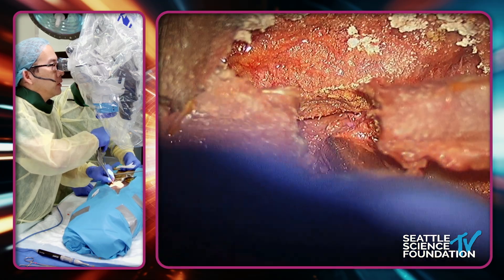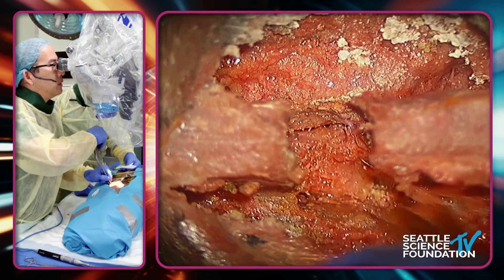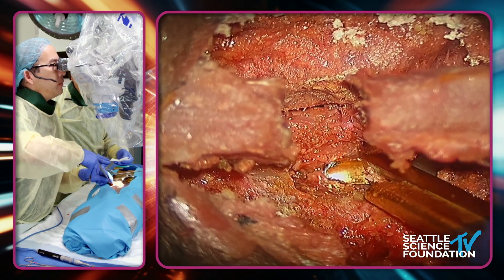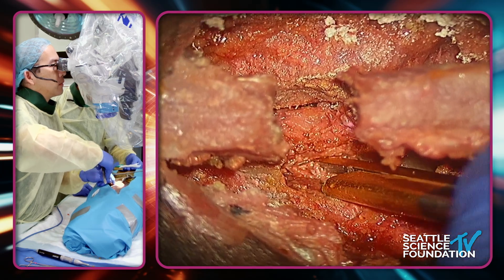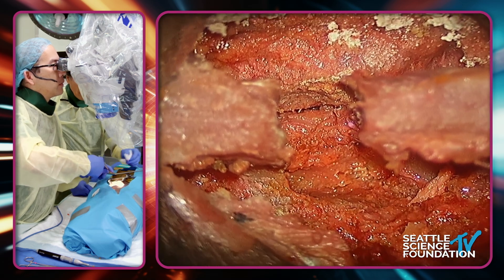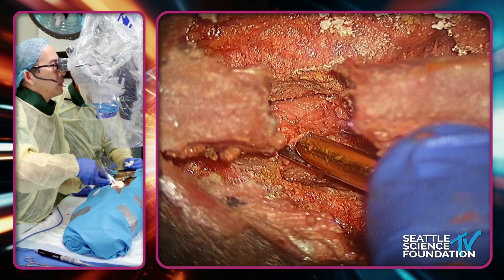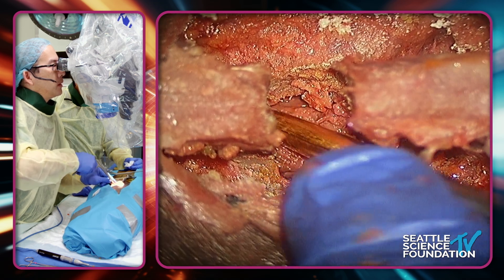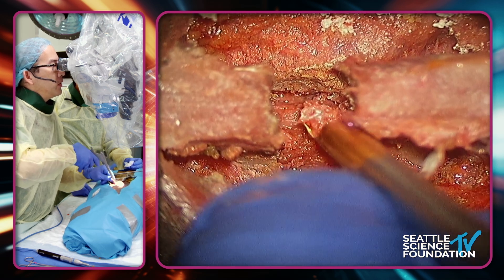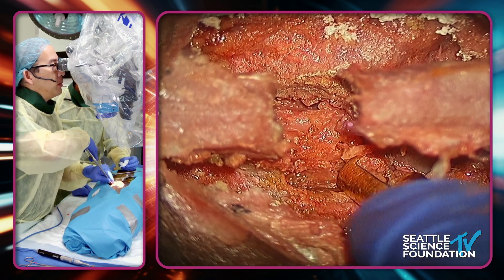I missed this because Dr. Zucker and I had to go to the lab. But the case he showed for the discussion session was a grade one to two spondy which had a dynamic component. The low hanging fruit is a fixed grade one spondy for CoFlex, but when it moves like that it makes me nervous to do a CoFlex in a mobile spondy. Was the case Dr. Ziegler showed with a little bit of mobility too much mobility for CoFlex? Yeah, I think the weakness in CoFlex is always flexion. If you feel like there's too much flexion, that's not going to be a great case, so I would move towards a fusion in that case or LimiFlex perhaps.